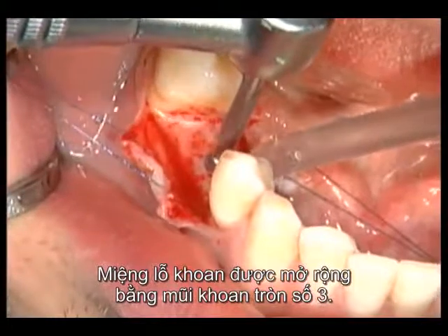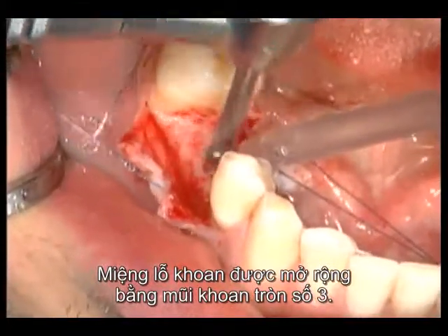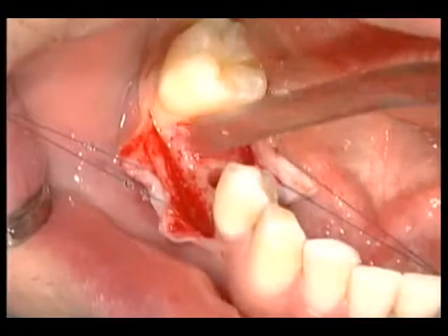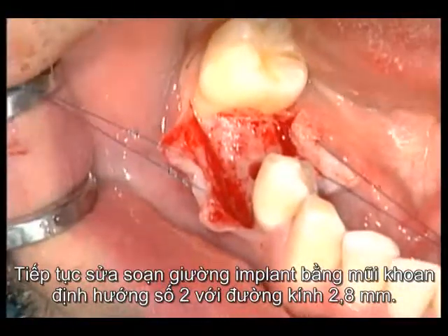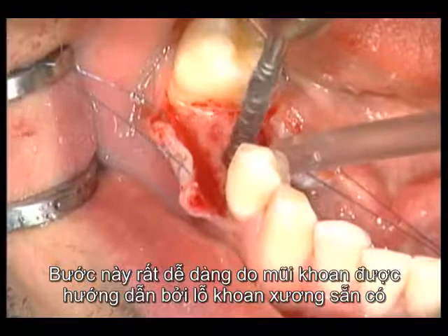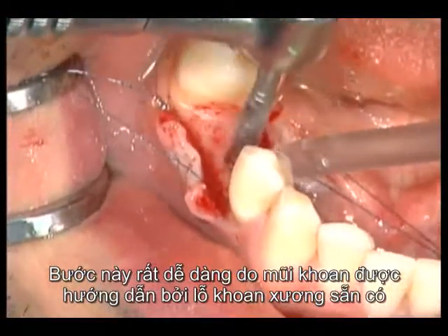The marking is widened with the third round burr. The implant bed is further prepared using pilot drill number 2 with a diameter of 2.8 millimeters. This step is very easy since the drill is guided by the existing bone bed.